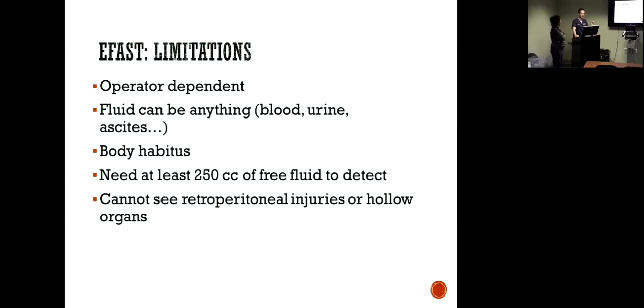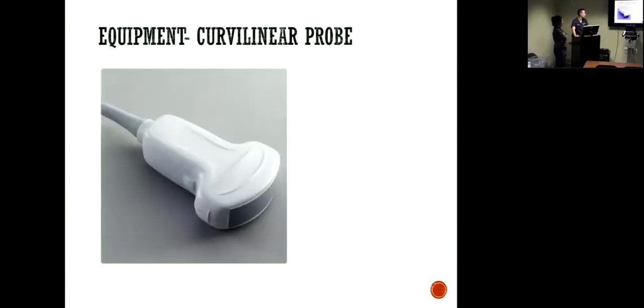So if there's a bowel injury, almost like a whiplash injury to their bowel, you're not going to always see that sort of thing. You want to see if there's injury to hollow organs. And if anything's in the retroperitoneum, back deep behind there, you can't see it.